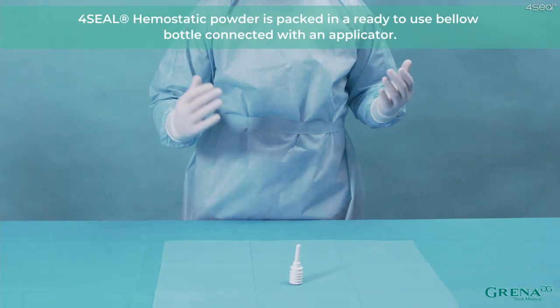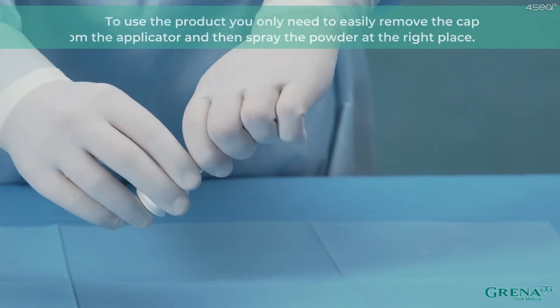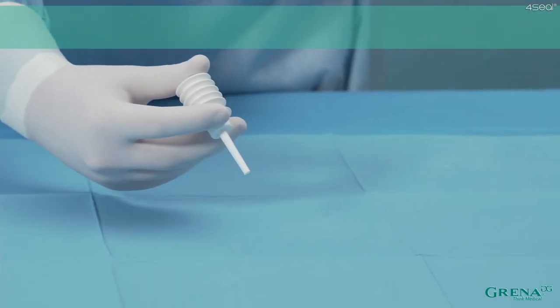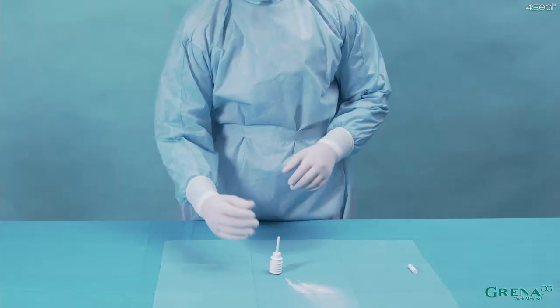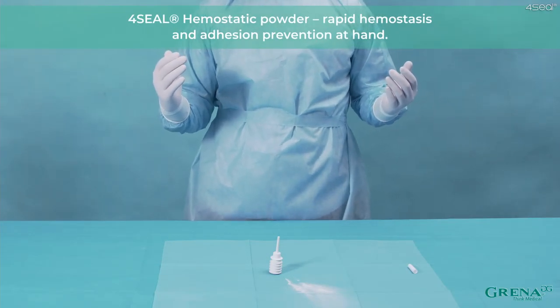4Seal Hemostatic Powder is packed in a ready-to-use bellow bottle connected with an applicator. To use the product, you only need to easily remove the cap from the applicator and then spray the powder at the right place. In 4Seal Hemostatic Powder, no extensive and time-consuming preparation is needed. 4Seal Hemostatic Powder — rapid hemostasis and adhesion prevention at hand.